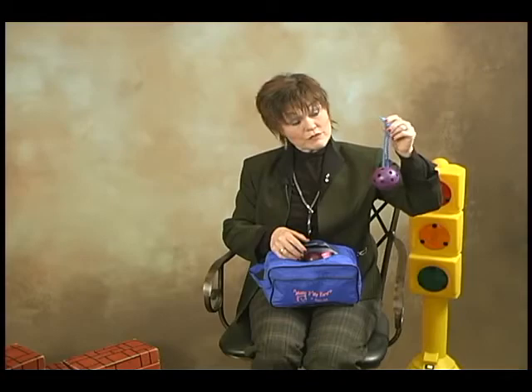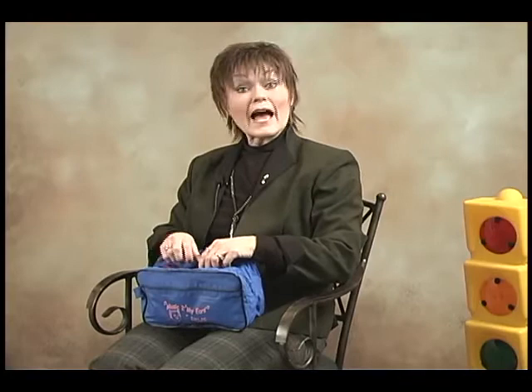It also has a startler horn for the very small or the newborn. We screen the toddler or the small child by first diverting their attention with a diversion ball. You can use a toy or anything of the such. The diversion ball is actually used to track their vision or hold it in front of them so that they are distracted, while the professional actually tests for the hearing.